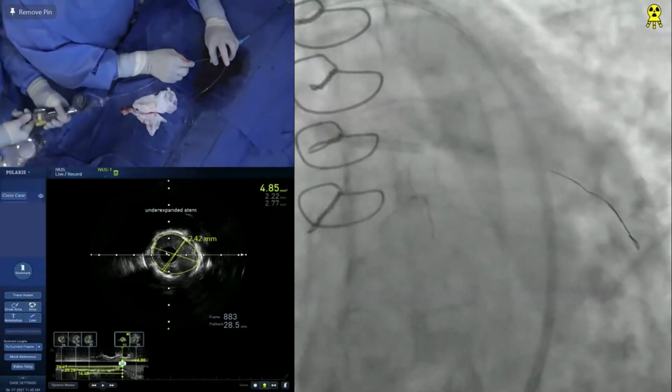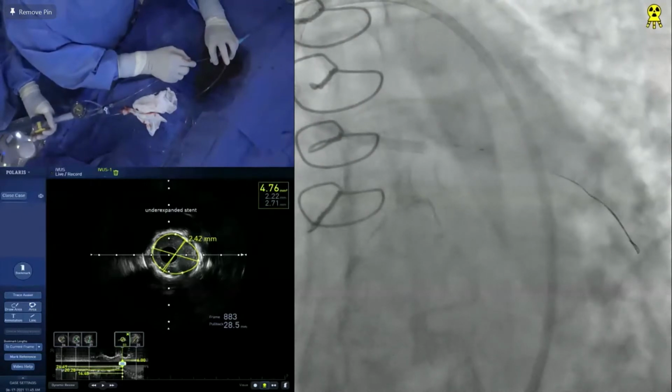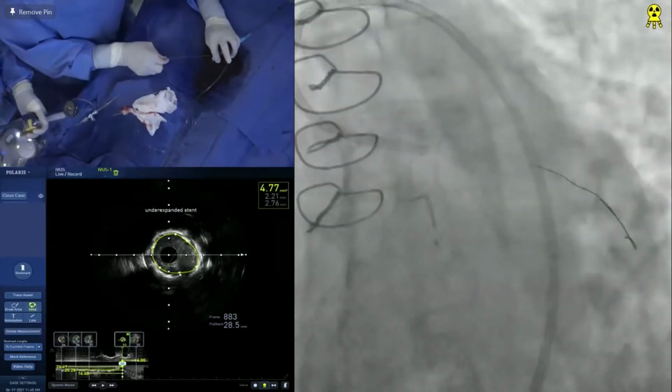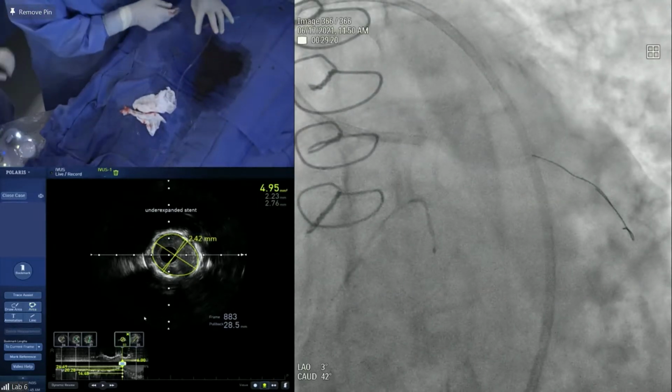We'll try to see negative. Let's take a picture and then we decide. We have a 4O cutter open, Wolverine. This can come out anyway. Yeah, I'd like to see the 4O cutter there.